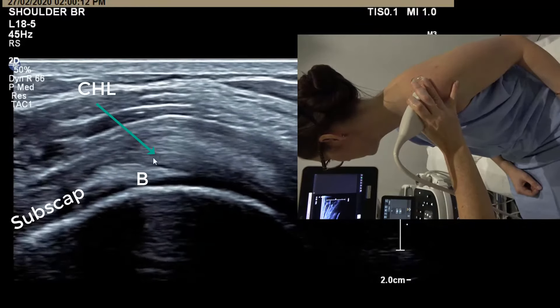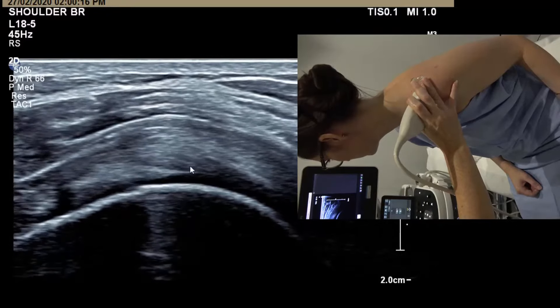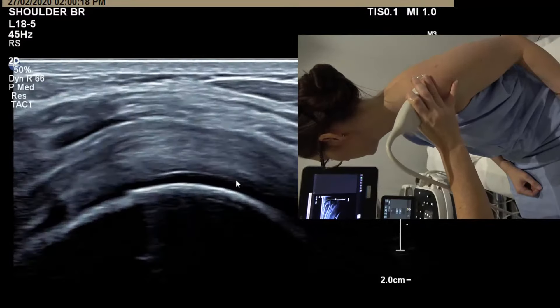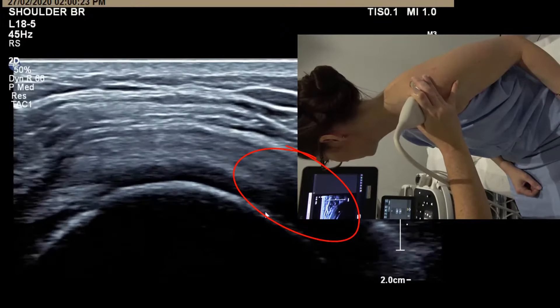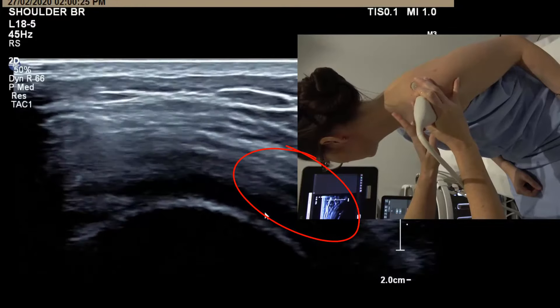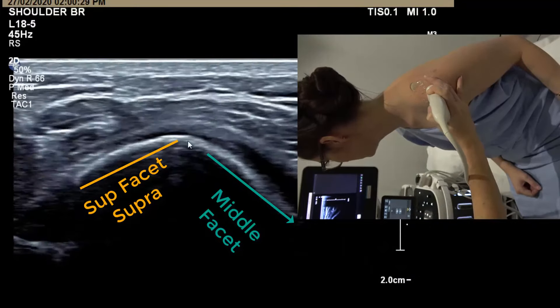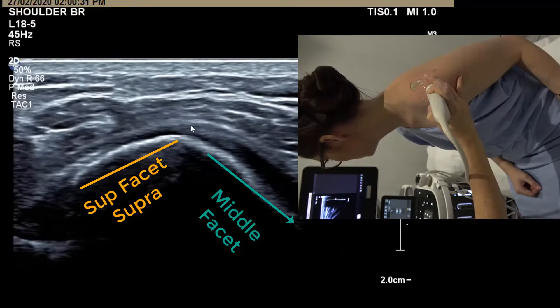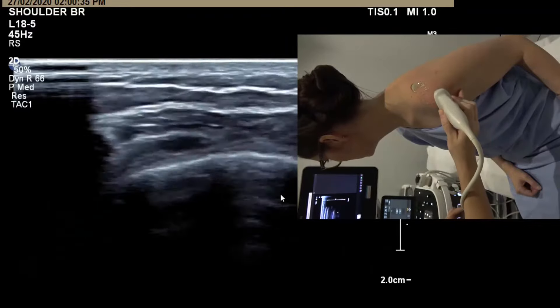You want to see the coracohumeral ligament coming over the biceps tendon and slinging underneath the supraspinatus. The only way to know where you've transitioned to infraspinatus is to go back towards the sleeve view, where you see a nice little knob — that point indicates where supraspinatus finishes and infraspinatus starts.